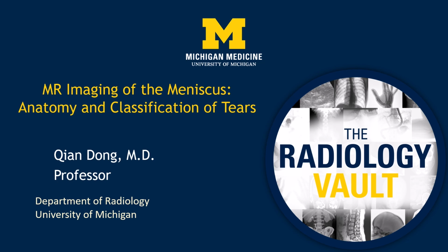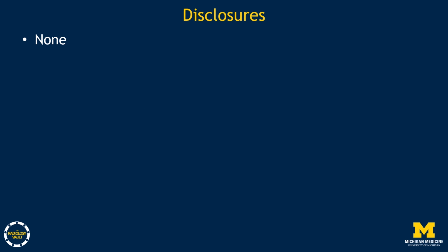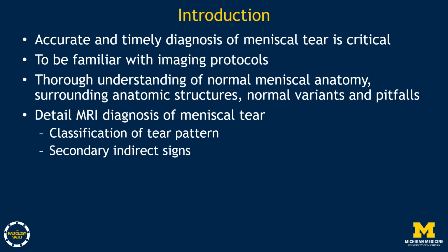Hi, my name is Qian Dong. Today we're going to talk about MRI imaging of the meniscus, anatomy, and the classification of tears. I have no disclosure. Accurate and timely diagnosis of meniscal tear is critical.